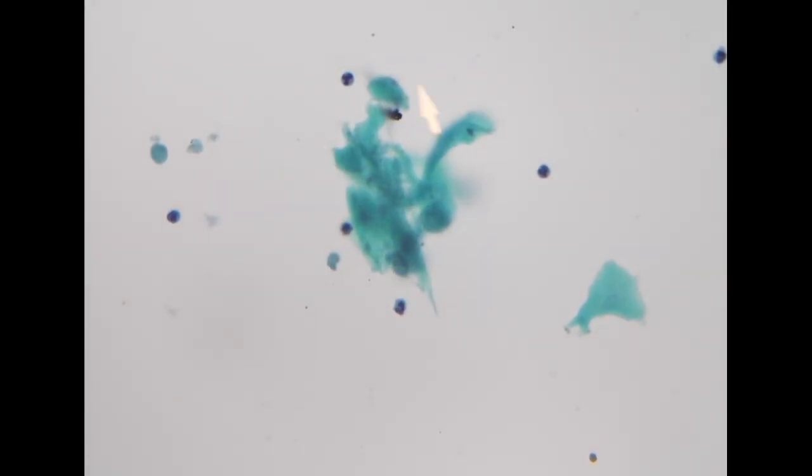So in the background, we can see cellular debris forming a polygonal shape without nuclei. So it seems to be necrosis, with squamous cells, a shadow type of cellular component. So this is quite common for squamous cell carcinoma.